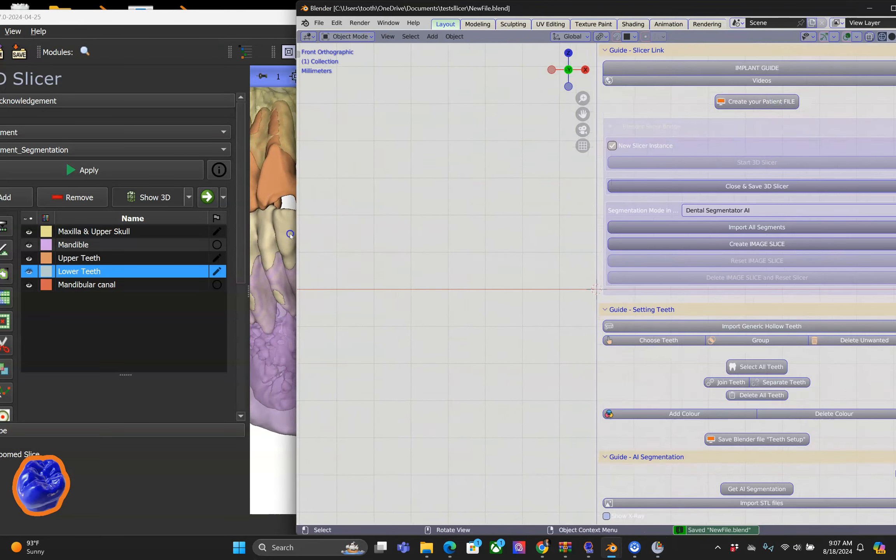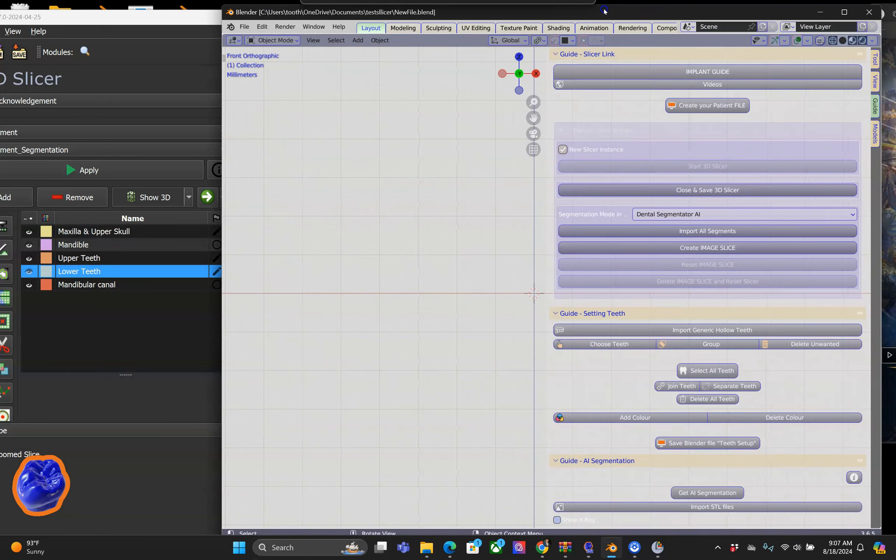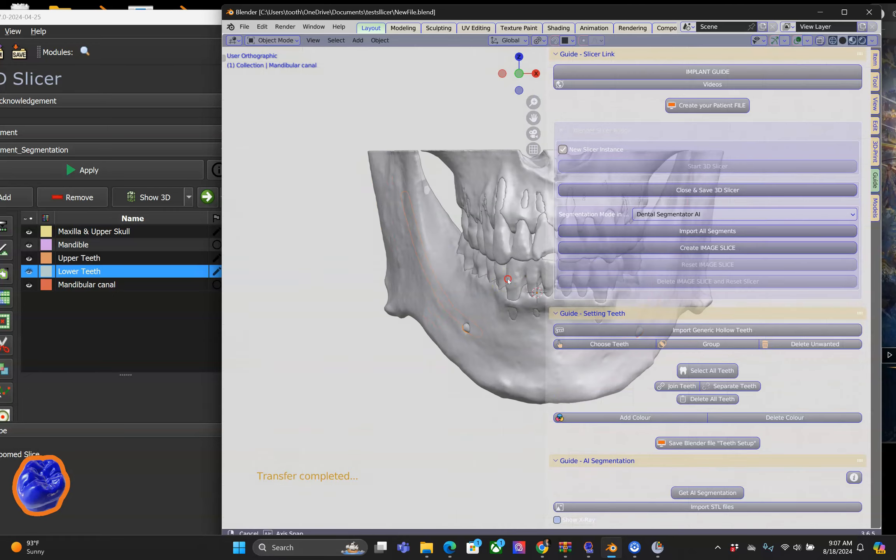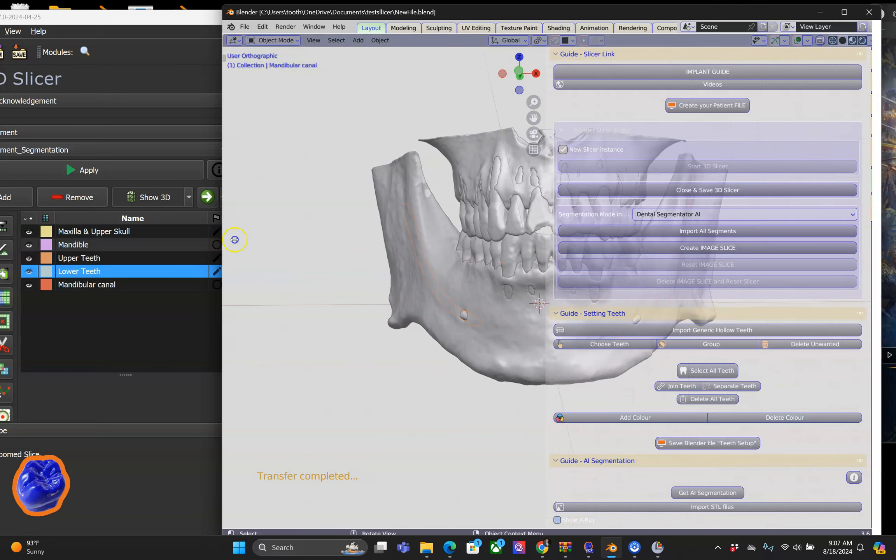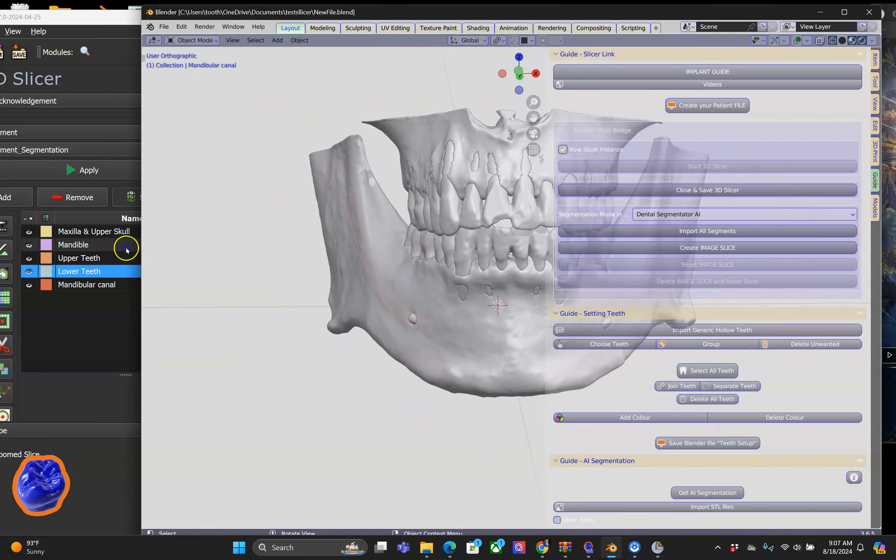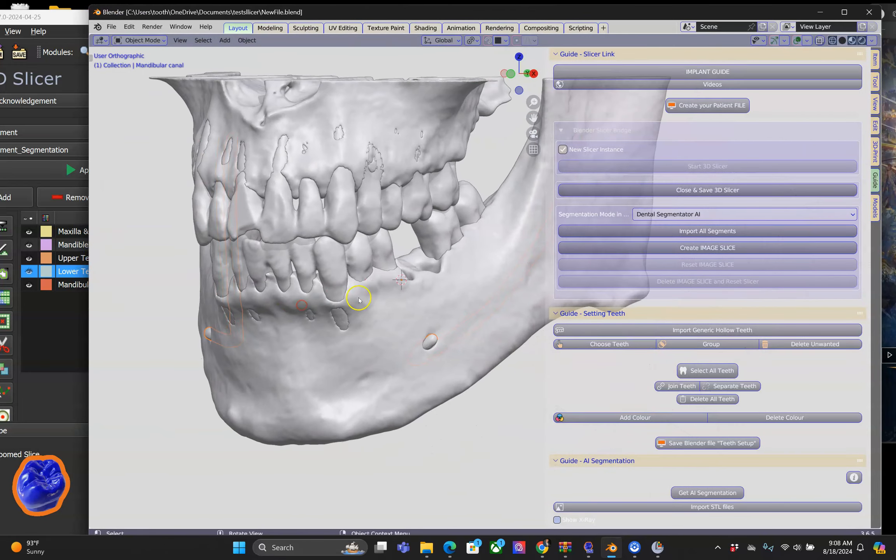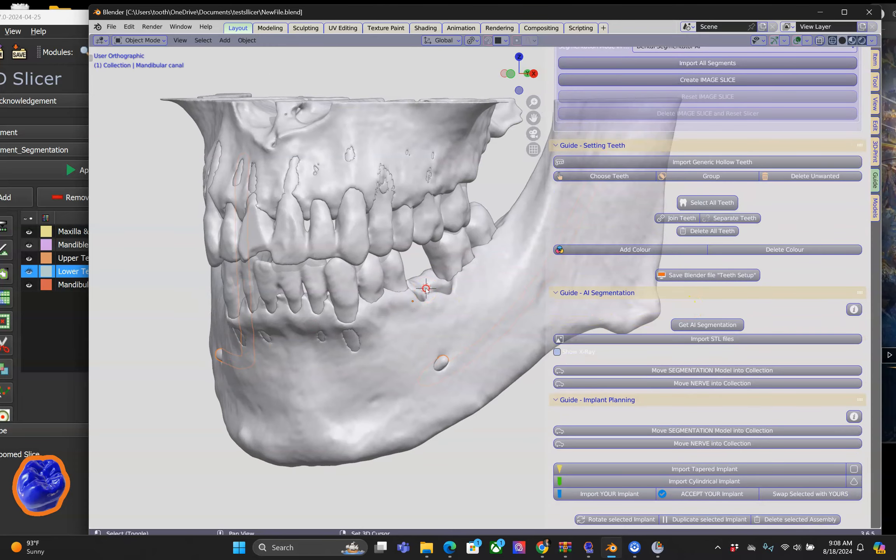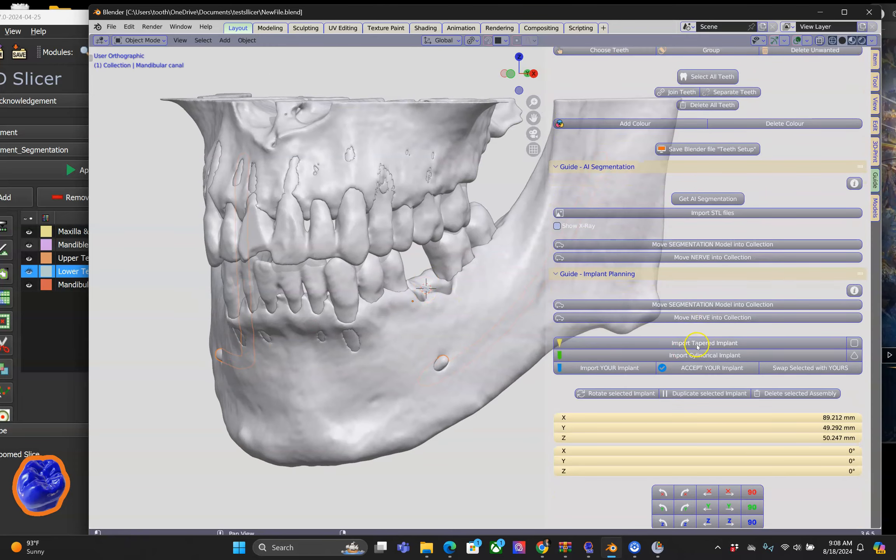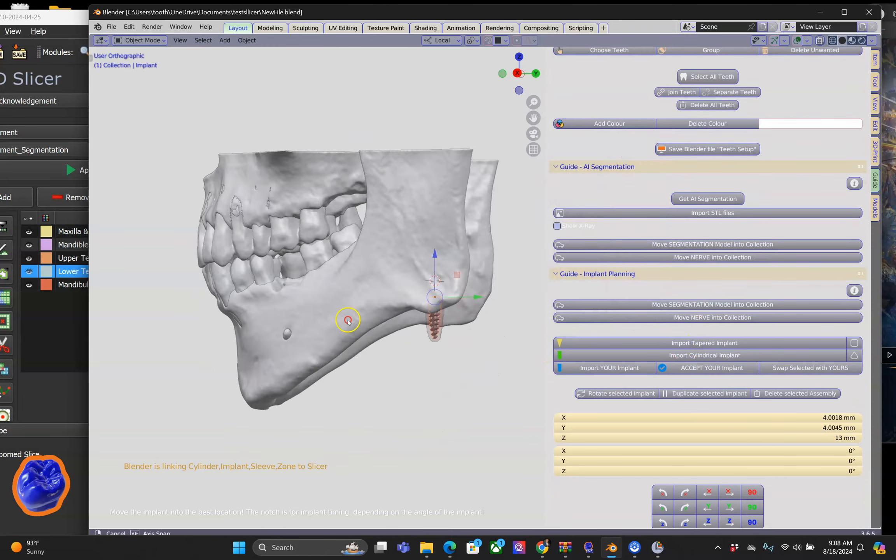I'm going to save my Blender file and then we're going to import the segmentation into Blender, and voila, with just one click we've got the correct orientation inside Blender.